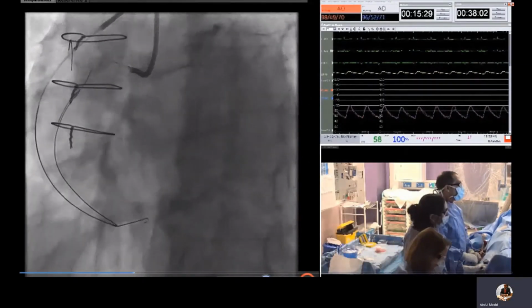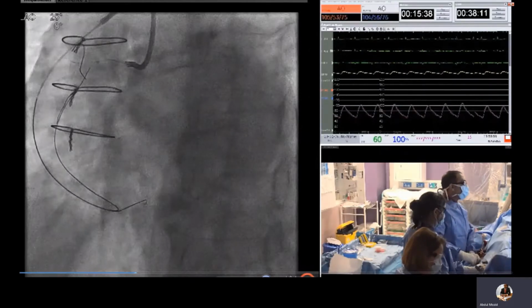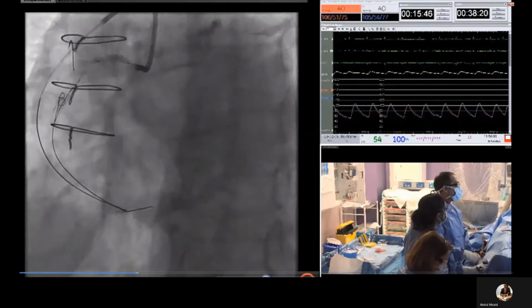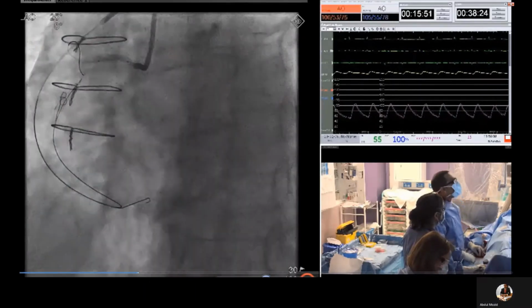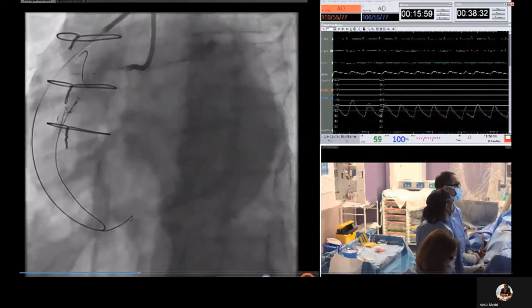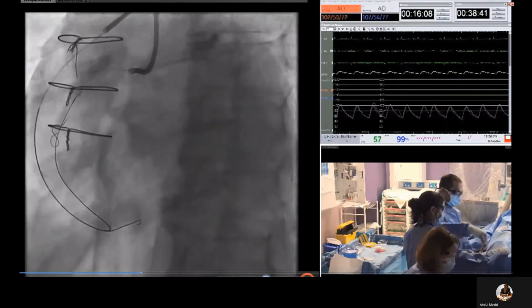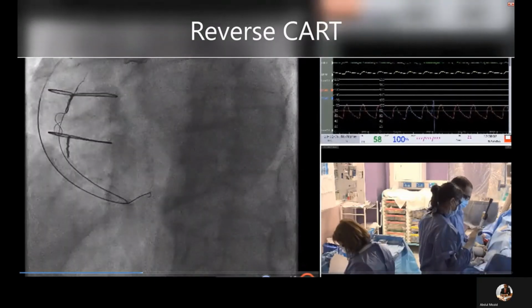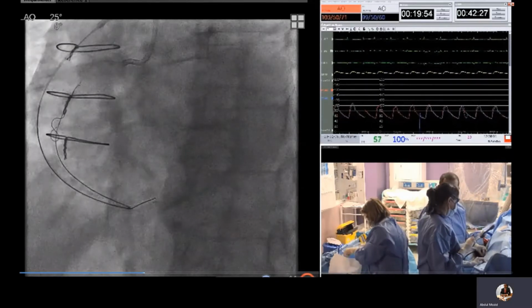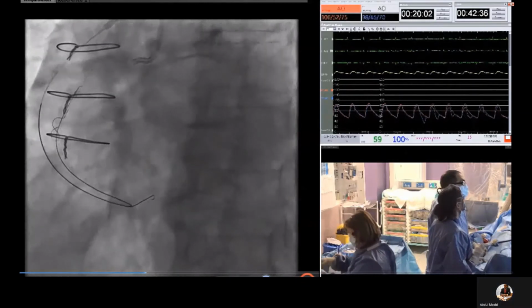The antegrade Mamba is then advanced, and we now have good wire position and very close to the retrograde equipment to perform our reverse CART maneuver. So we're now set up for reverse CART. So we advance a 7 French guide extension, in this case a Guidezilla.